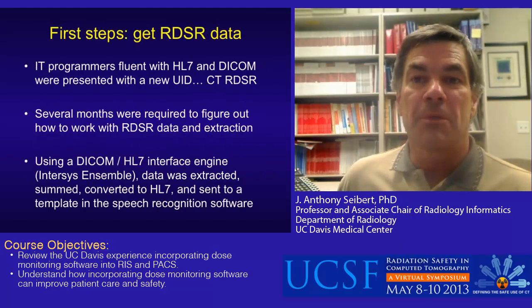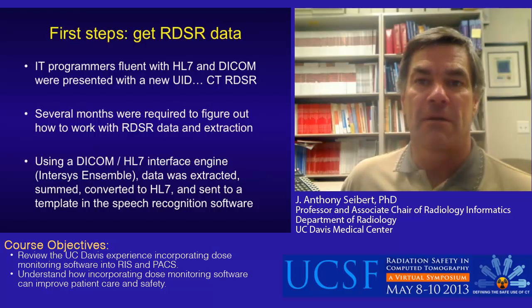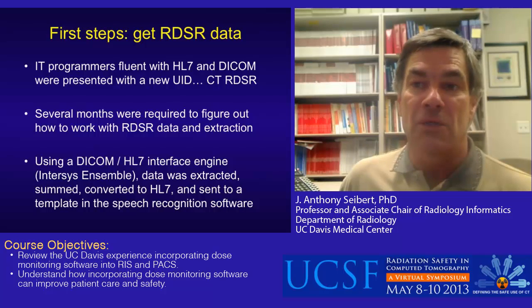The recently implemented RDSR DICOM module was not without challenges because of a new DICOM unique identifier and the lack of software to interpret the contents. In fact, when we initially sent the RDSR data to the PACS, it conflicted with our hanging protocols and disrupted radiologist workflow, so we stopped that feed. Several months of effort were required to determine how to get the dose data and ultimately validate the values.